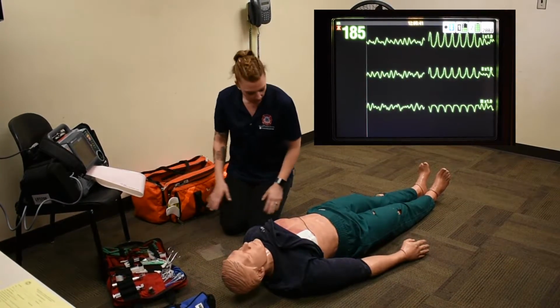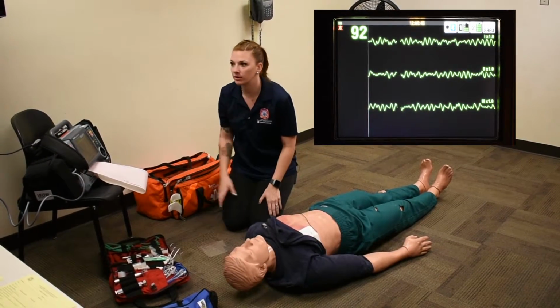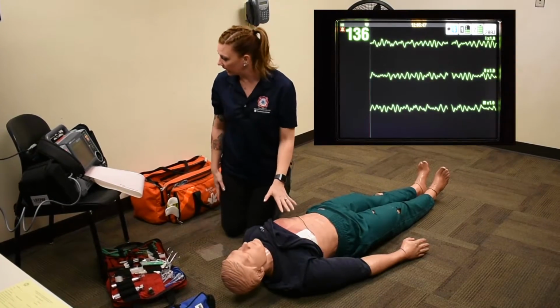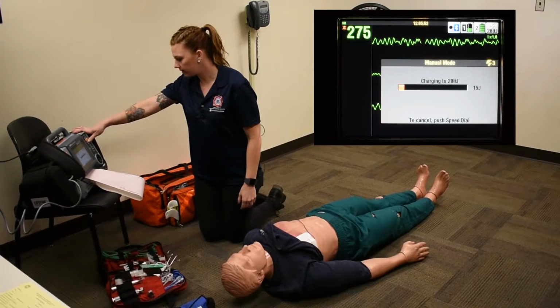I see that we have a rhythm change. I'm going to check for a pulse. Do I have a pulse? There's no pulse. I have VFib on the monitor. We're going to continue CPR again, doing CPR while I am charging for a defibrillation at 200.